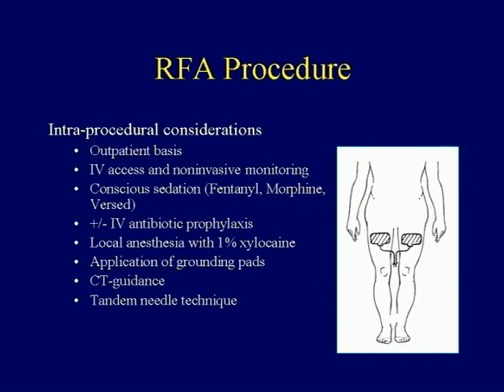You obviously have to have good monitoring during the procedure. There's a big debate as to whether these should be done under conscious sedation or under general anesthesia. We have taken the route of conscious sedation and, of course, local anesthesia. The application of the grounding pads, you need to obviously have a good CT scanner, preferably now something with fluoroscopy, but not required. All of the procedures done to date have been done without fluoroscopy at our institution, and we use a classic tandem needle technique.